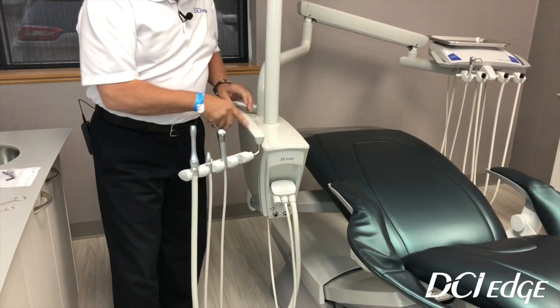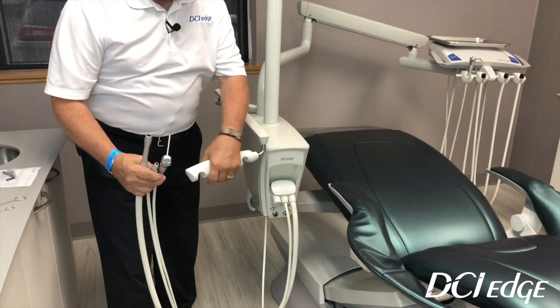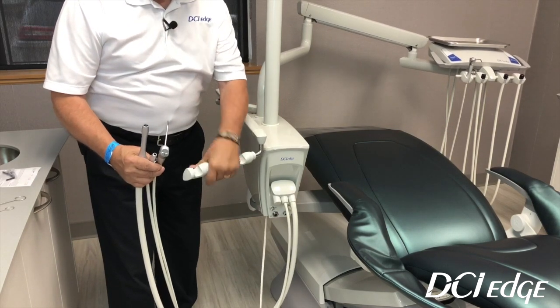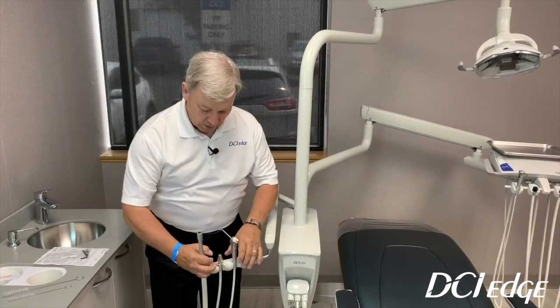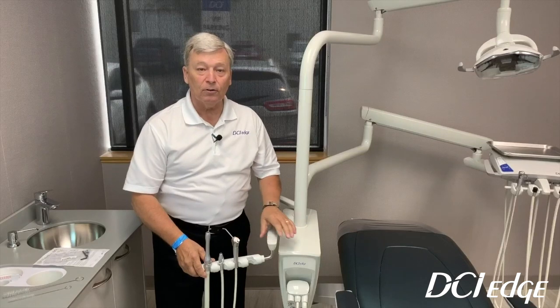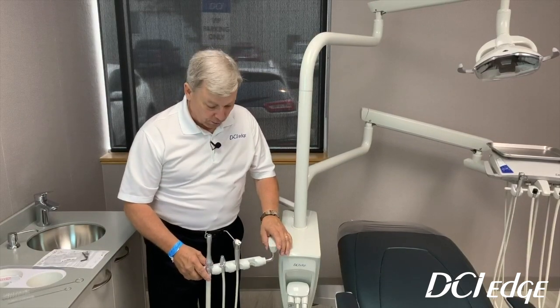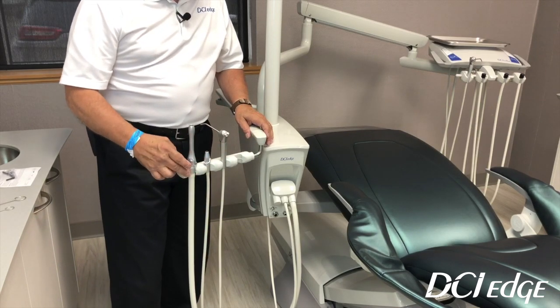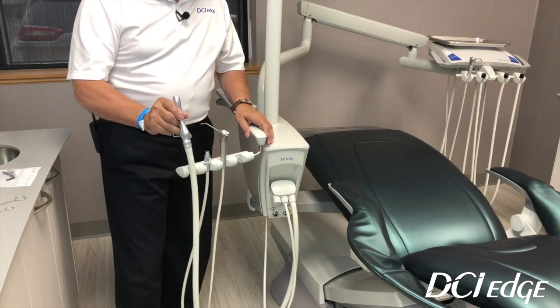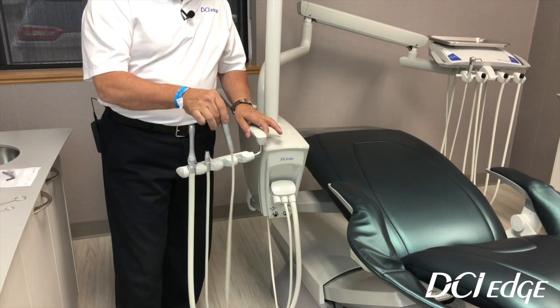It has a 360-degree swivel on the neck, and the handpiece holder itself will continuously rotate 360 degrees, so whatever angle the assistant would like to have her dynamic instruments at, she can position them comfortably. We supply a four-port bar on this, and with it you will get one HVE valve, a saliva ejector valve, and a three-way syringe.